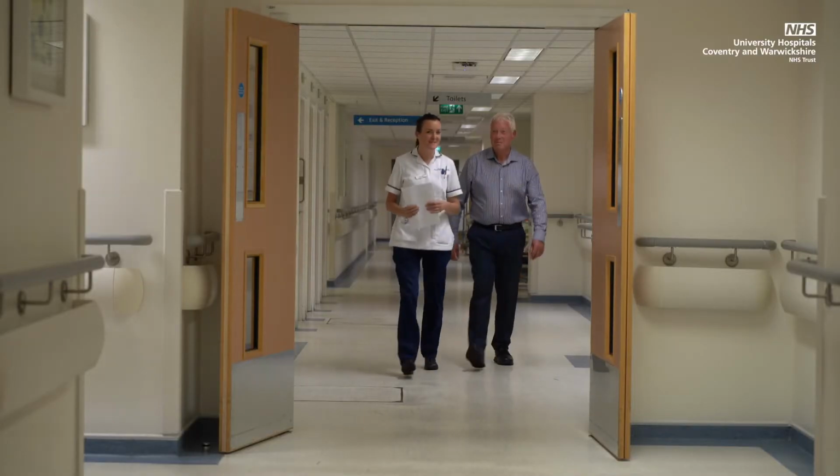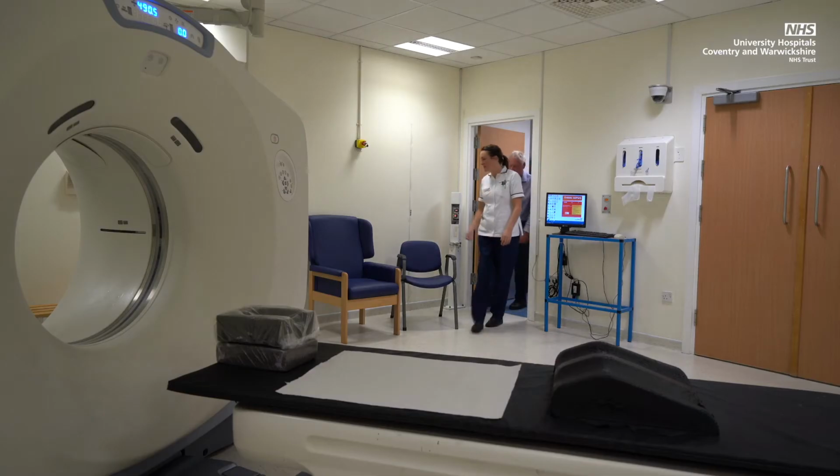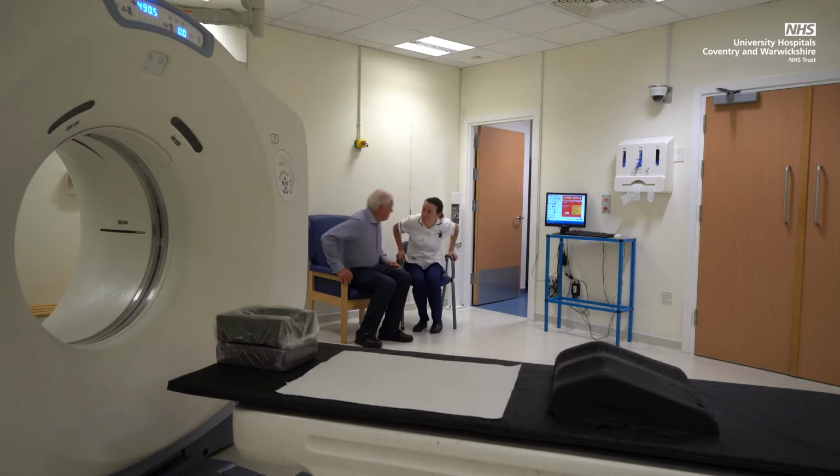It is just like a normal CT scan, but there might be some preparation needed beforehand. This depends on the area that we are treating, and any preparation required will be explained to you before your CT appointment. Before you are taken in for your scan, the radiographer will have a chat with you to inform you about what to expect. During this chat, we will check that you have given your consent for the treatment. You will also have the opportunity to ask any questions that you may have. After the radiographer has gone through all the necessary information, you will be taken into the CT scanner room.